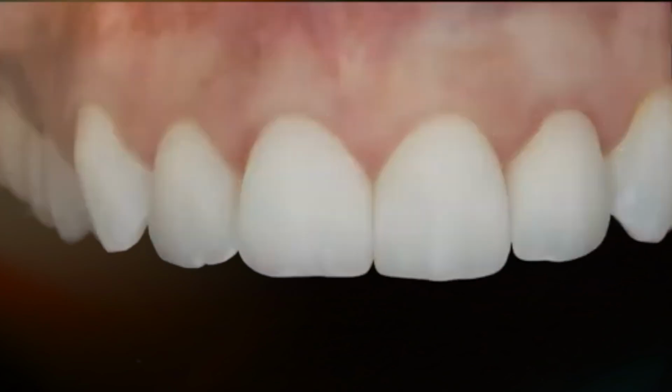Now this works fine, however, it's technician dependent. So if you depend on an analog technician to layer in a nice way, it's just the same, but more difficult because staining has less tools than a person that does layering has. So you don't really get away from the requirement of the technician being highly artistically skilled.